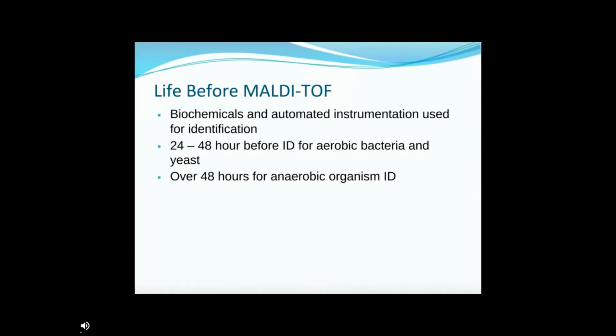So a little bit about our life before MALDI. Biochemicals and automated instrumentation were always used. So it would take us between 24 to 48 hours before we would actually get that identification. And anaerobes, as you know, take a little bit longer to grow.